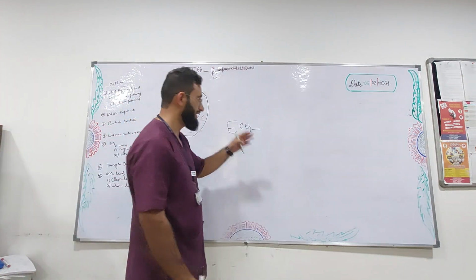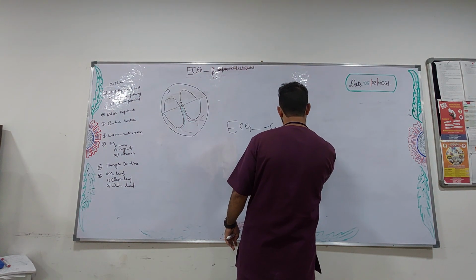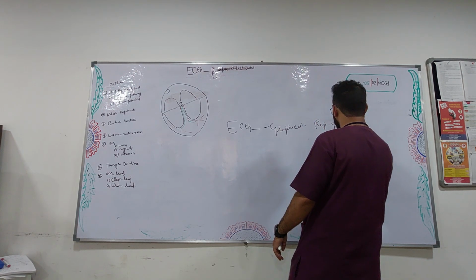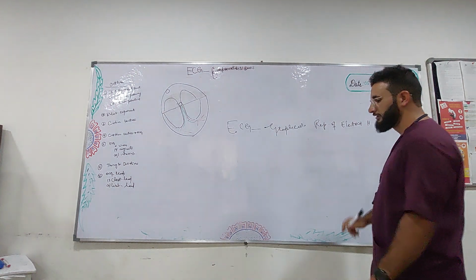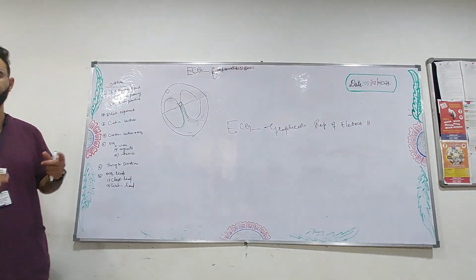It's a graphical representation of electrical activity of the heart. So to understand ECG, we should first know the basics.